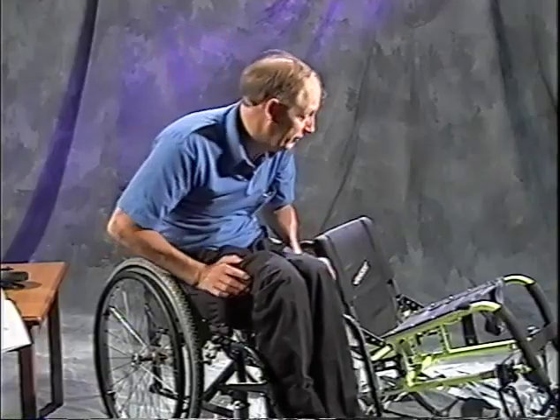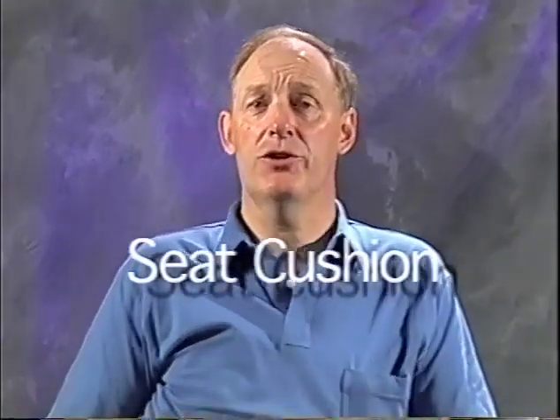But the general rule of thumb is don't go so long that the chair is hard to turn around and has a long swing whenever you're turning, and not too short that you can't sit in it comfortably without your legs flopping around. And that's pretty much all there is to really the seat length of a chair. Okay. In this section, we're just going to look briefly at cushions.